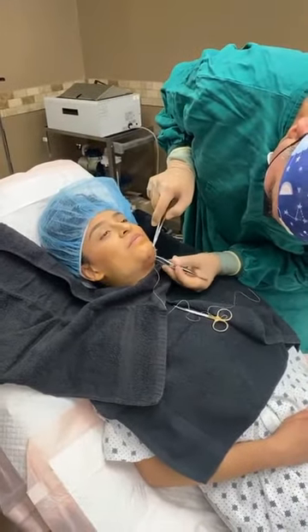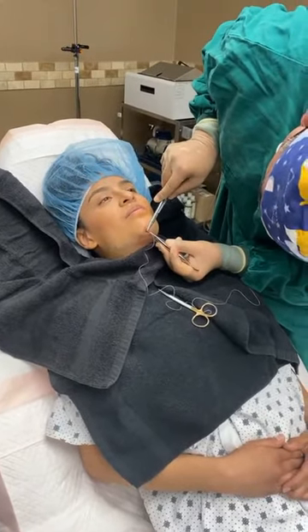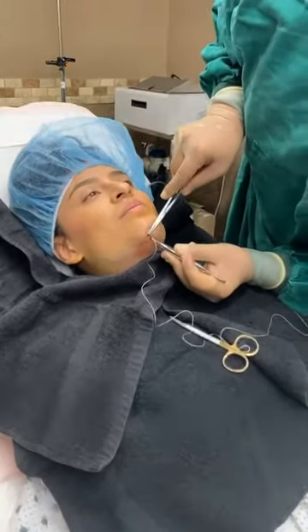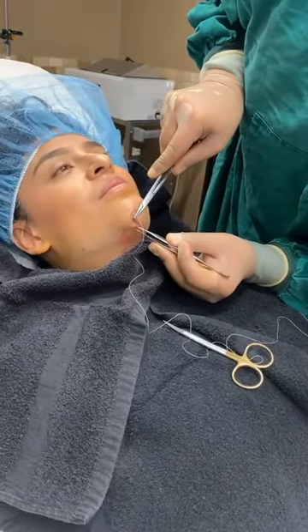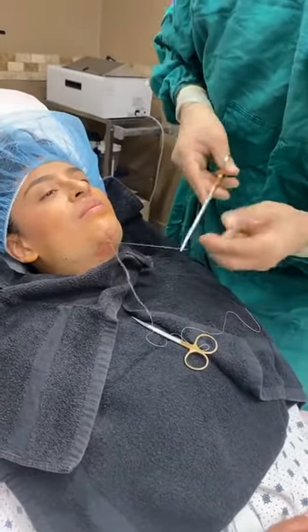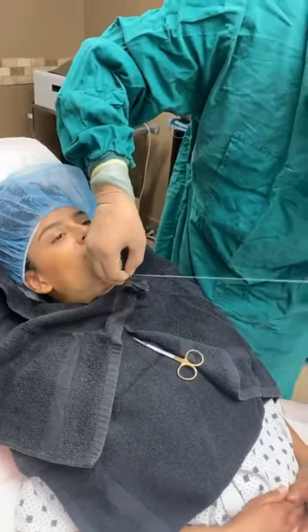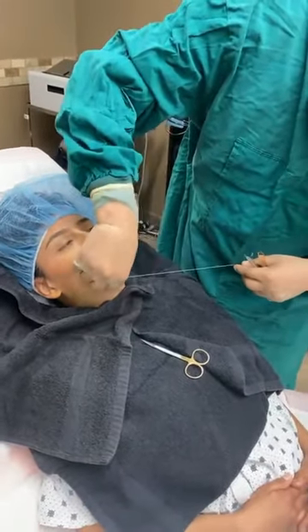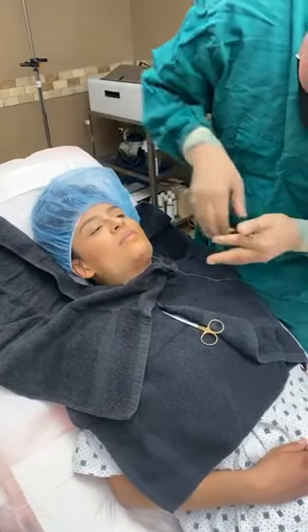And I'm simply going to go ahead and do a very, very tiny mark, just reapproximating that skin. And this will dissolve. This does not have to be removed. It'll dissolve by itself. If it's still there in a week, I'll go ahead and remove the stitch.